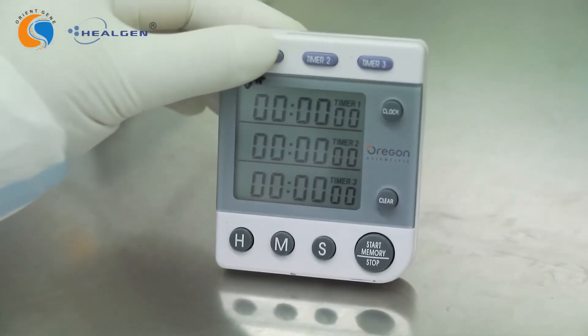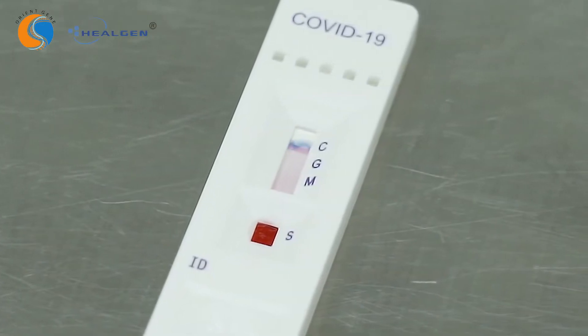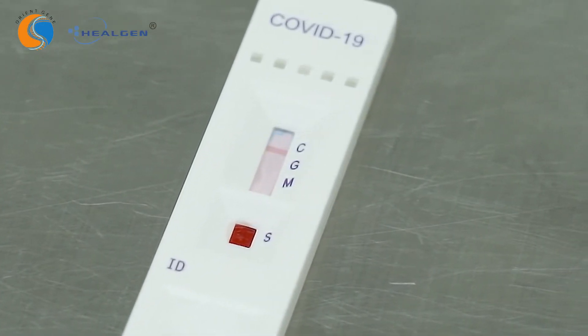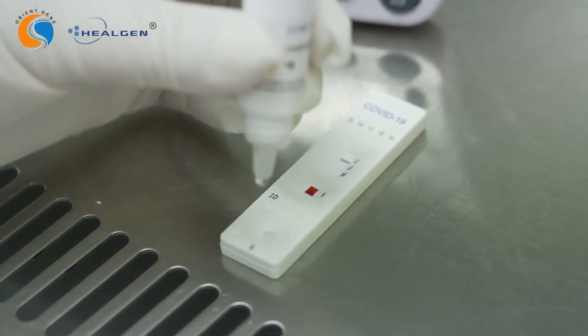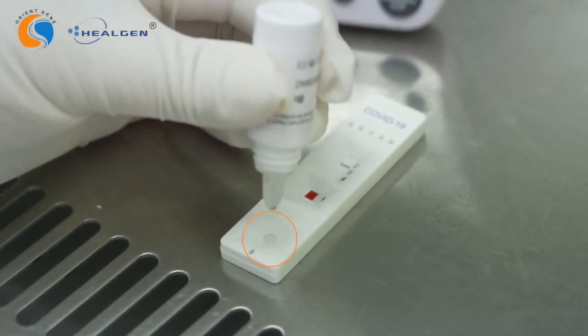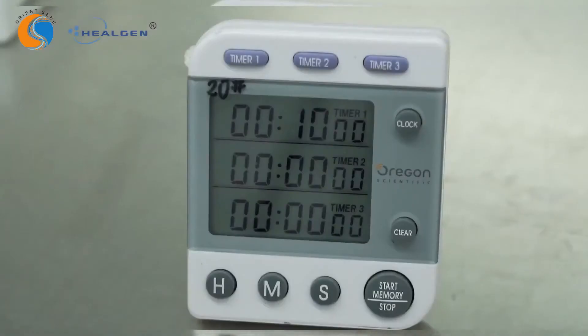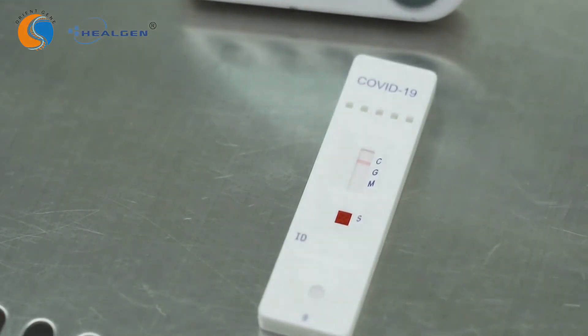Start the timer. If, after two minutes, the sample has not moved across the test window or if blood is still present in the sample well, add one additional drop of buffer to the buffer well. Read the test result in 10 minutes. Do not interpret the results after 15 minutes.